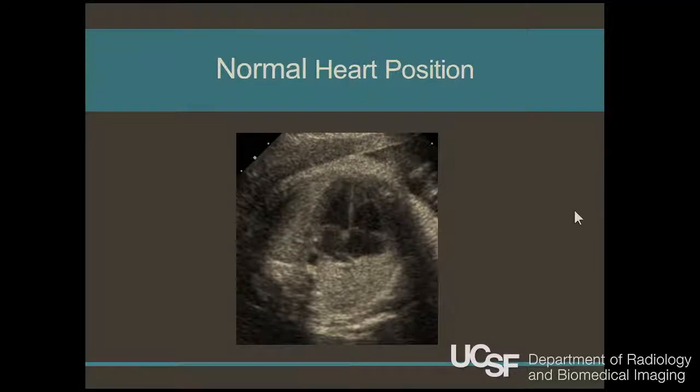When you look at an obstetrical ultrasound, people always talk about the 4-chamber view of the heart, which is an important view to get. You want to look at the 4 chambers. Again, I always start with the spine, and you can see the descending aorta here. If you want to identify the chambers instead of just calling them 4 chambers, you want to actually look at this and say, okay, here's the aorta. Touching the aorta is the left atrium, which makes that the right atrium, which makes that the right ventricle, and the left ventricle. And in the right ventricle, you'll have the moderator band, and it's also the most anterior chamber in the heart, assuming the heart is normally developed.